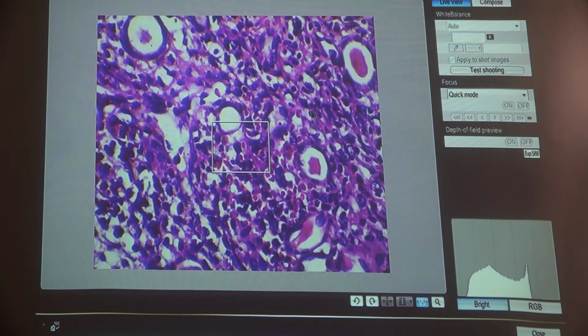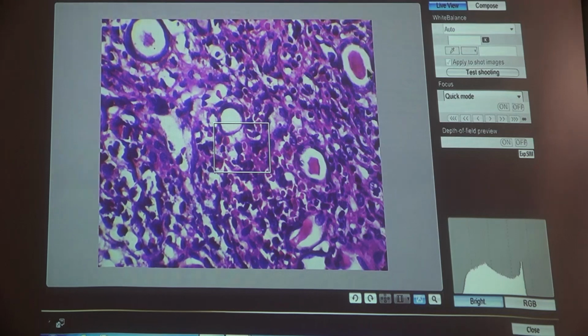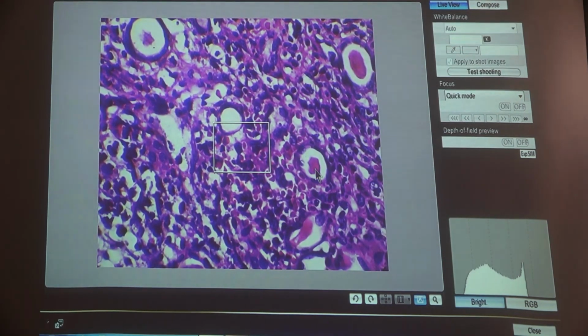This is the renal tubule, this is renal tubule, this is renal tubules. This is the hyaline cast. It is also called thyroidization of the kidney. This is a chronic inflammatory process in which chronic inflammatory cells, mainly lymphocytes, histiocytes, in the tubules and in the interstitium, result in destruction of the renal tubules with formation of hyaline cast and inflammation of the renal parenchyma.